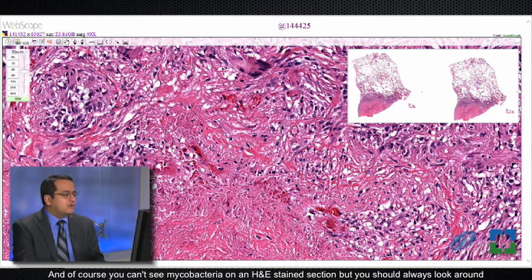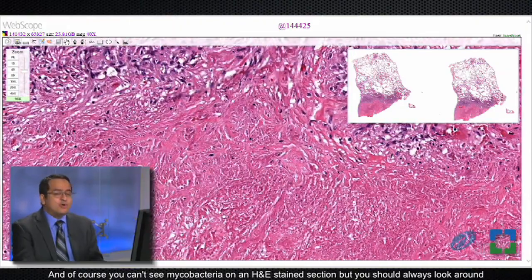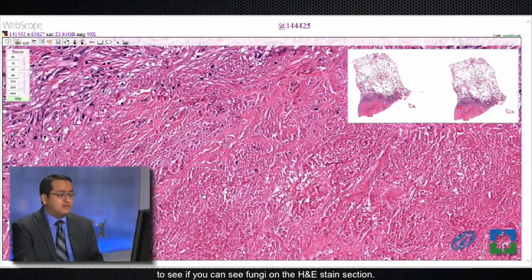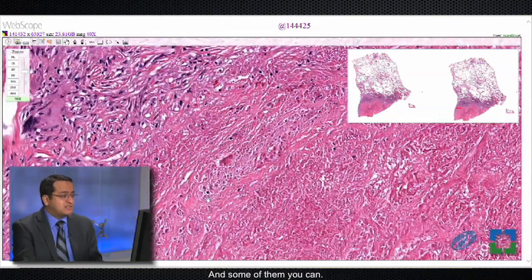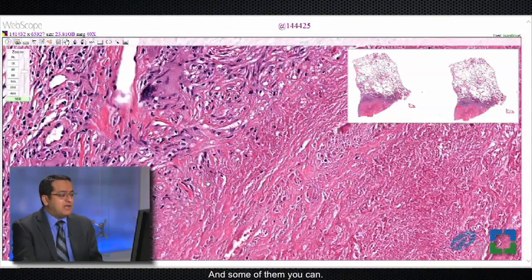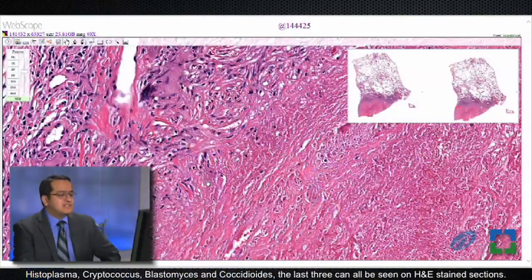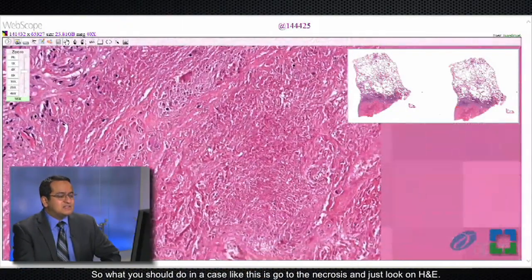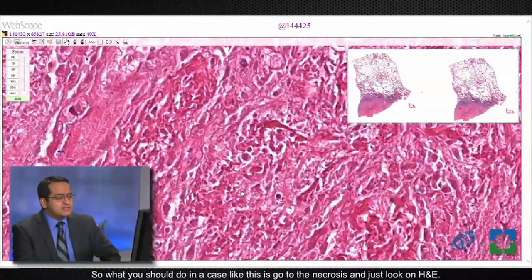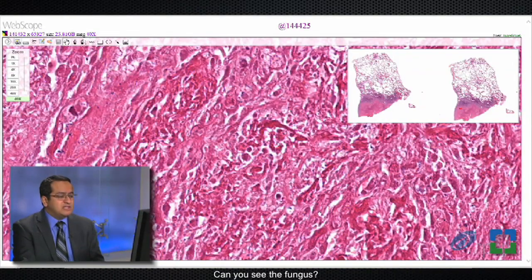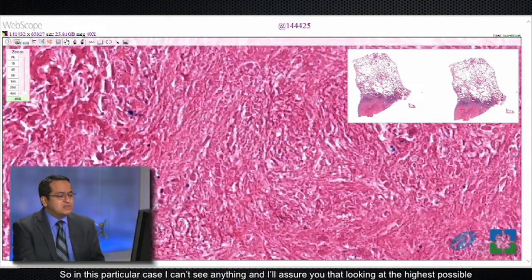As most of you know, the differential diagnosis of a necrotizing granuloma first and foremost includes infection — mycobacterial or fungal infection. You can't see mycobacteria on an H&E stained section, but you should always look to see if you can see fungi on H&E, and some of them you can. Out of the four most common fungi seen in these necrotizing granulomas — histoplasma, cryptococcus, blastomyces, and coccidioides — the last three can all be seen on H&E stained sections.